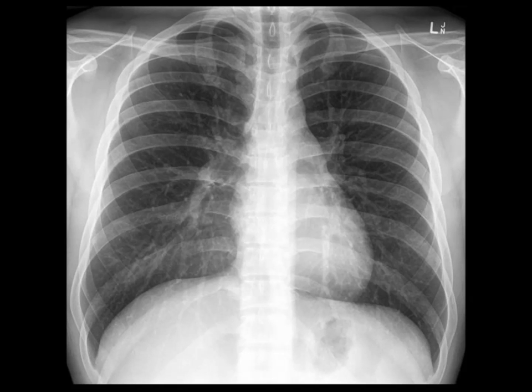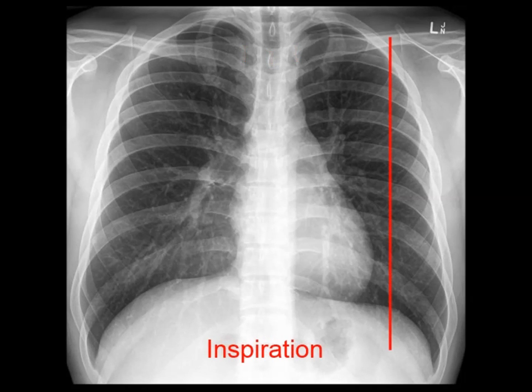To check rotation, look at the clavicular heads and spinous processes. If the spinous processes are halfway between the clavicular heads, the patient is normally rotated. Next, check for adequate inspiration by looking at the mid-clavicular line and seeing which anterior rib intersects the diaphragm at this point. It should normally be the 5th, 6th or 7th. More ribs means the lungs are hyperinflated, often seen in COPD. Fewer means the patient may not have taken a full breath when the x-ray was taken.